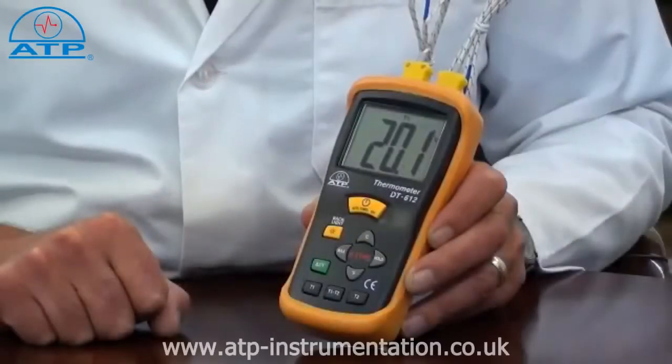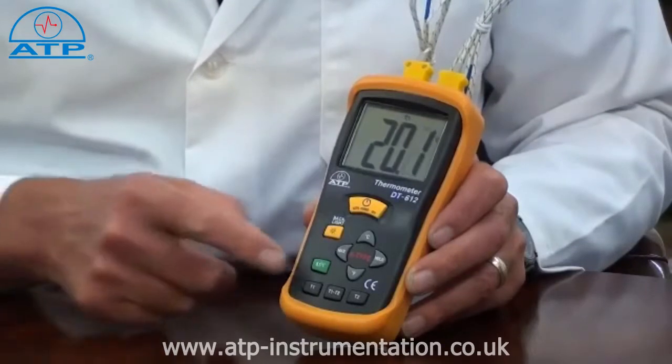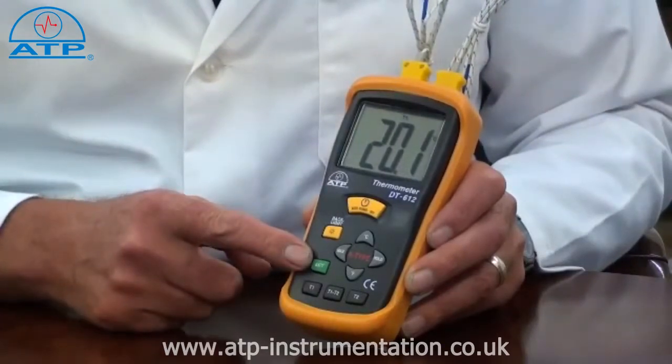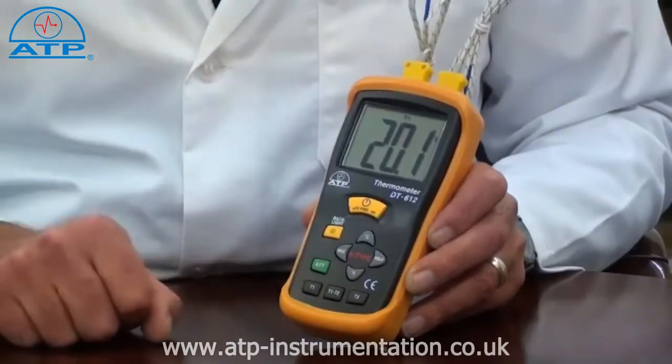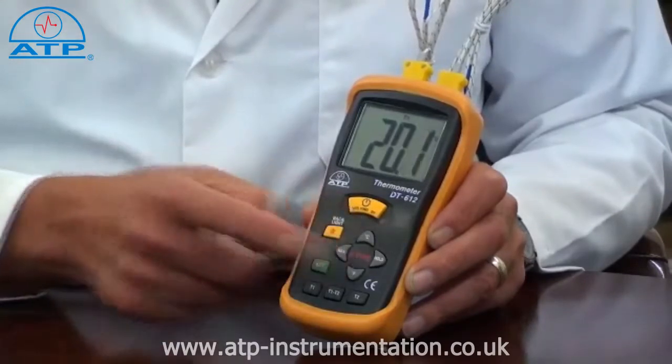It has a measurement range from minus 50 to 1300 degrees C with an overall resolution of 1 degree, but has a selectable resolution of 0.1 or 1 degree below 200 degrees. The user can select readings to be displayed in degrees C or degrees F.